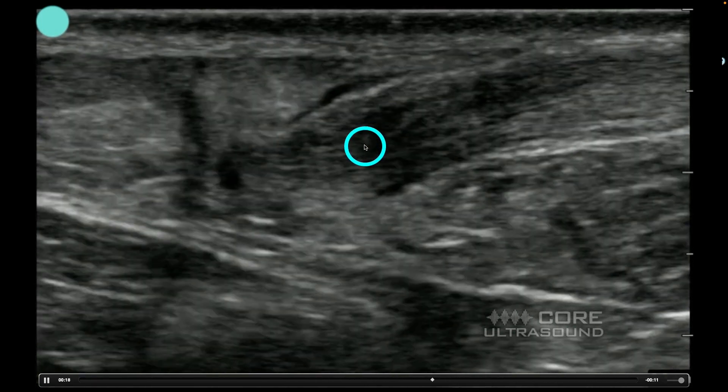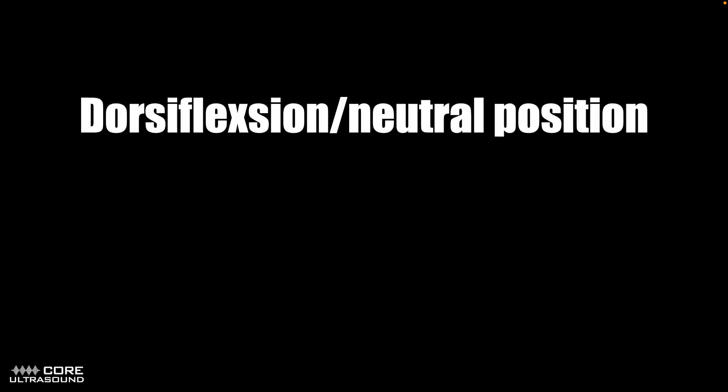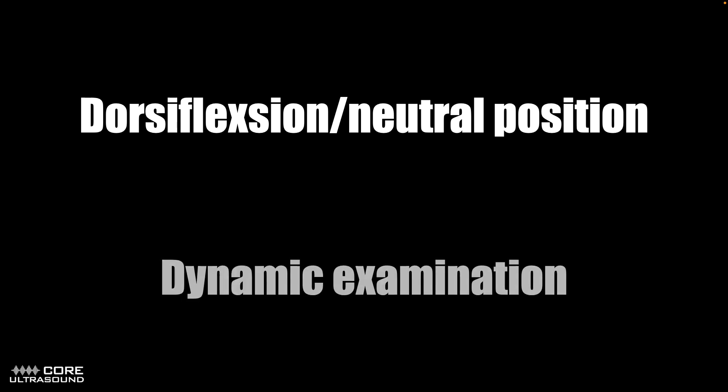I'm doing some slight dorsiflexion to see that the two ends are not connected. To recap: to position that foot, you want to have it in a little bit of dorsiflexion or a neutral position, just so that the surface where you're placing the transducer just proximal to the calcaneus is flat and you're able to make perfect contact. And don't be afraid to do a dynamic examination — just gently and slowly dorsiflex and plantarflex that foot to see if there are two ends of that Achilles tendon that are not attached.